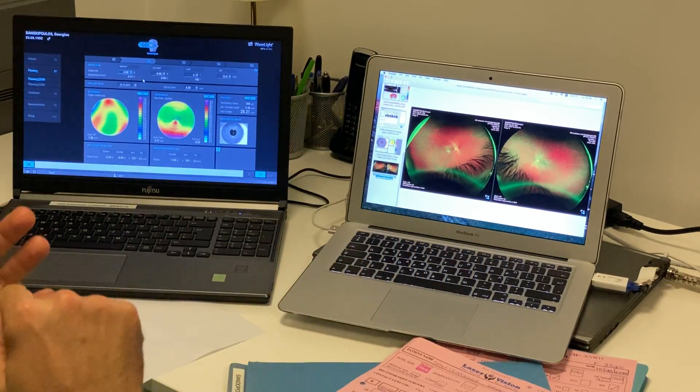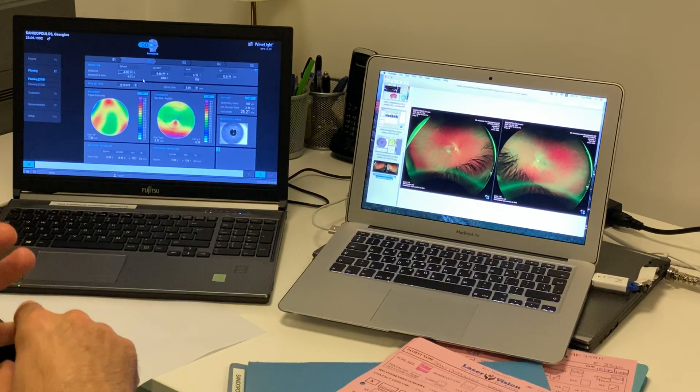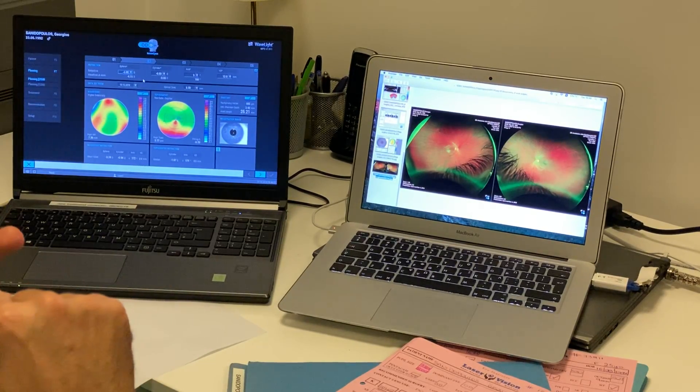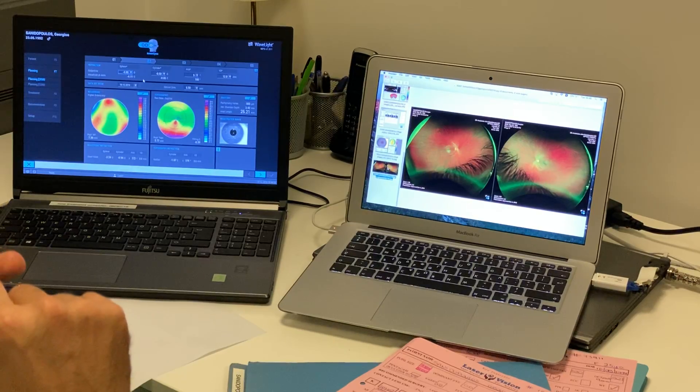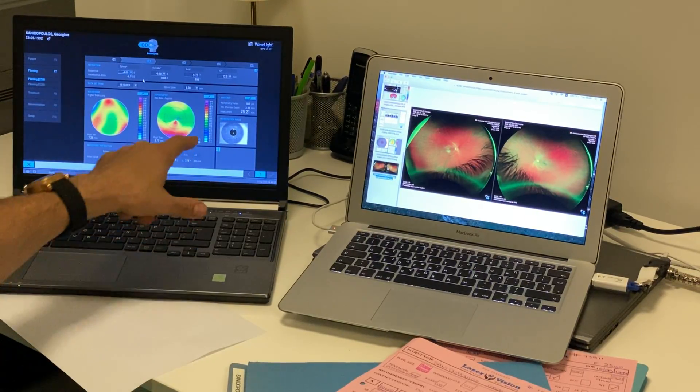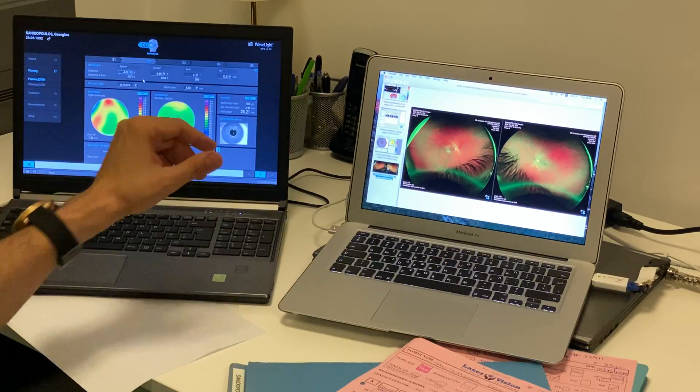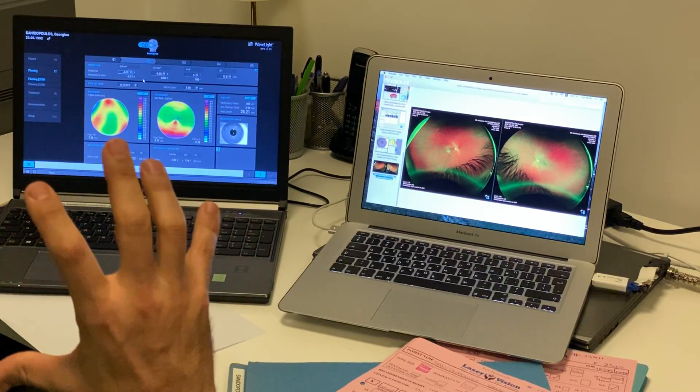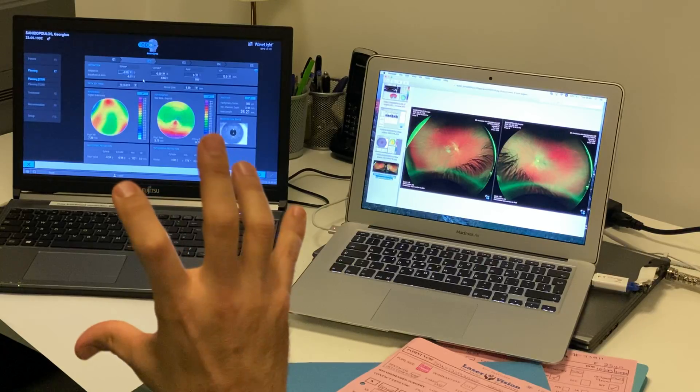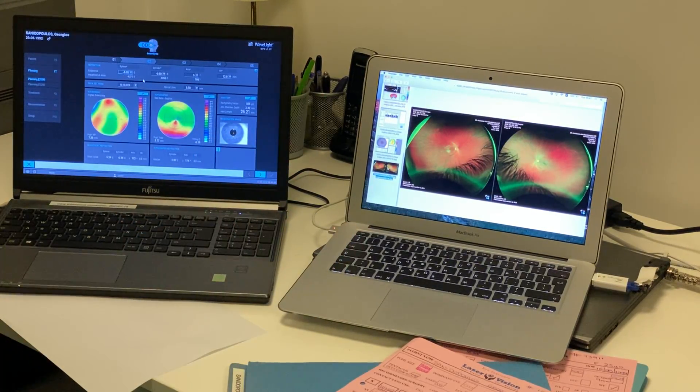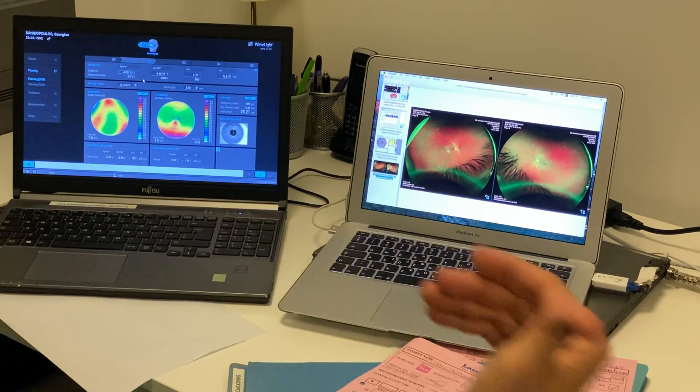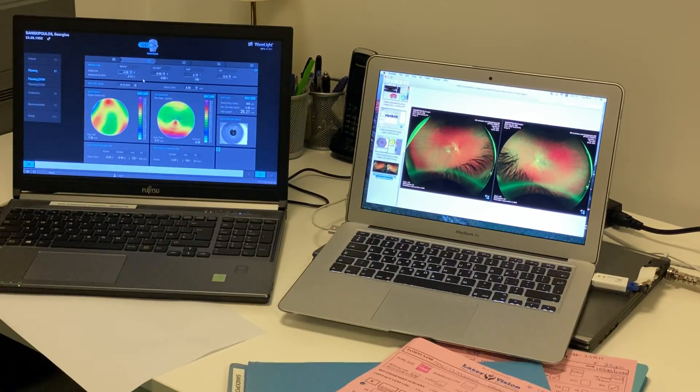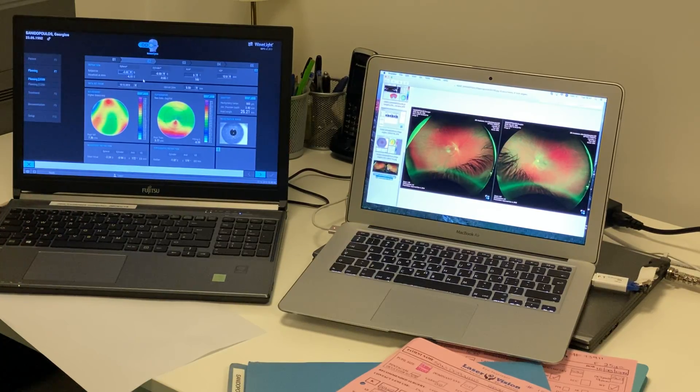It's a single device, which includes a wavefront analyzer, Hartmann-Shack wavefront analyzer, a very high-end Scheimpflug tomographer, and interferometry to measure axial length, as well as infrared camera to capture the iris architecture and topographic location of all these specific iris registration marks that will be used later for the treatment, as well as pupillometry, as you can see here.